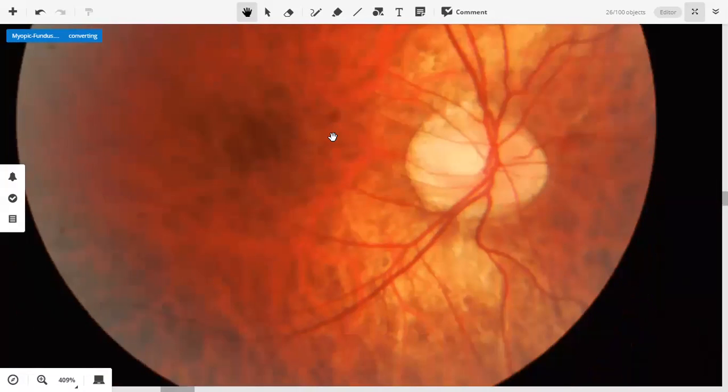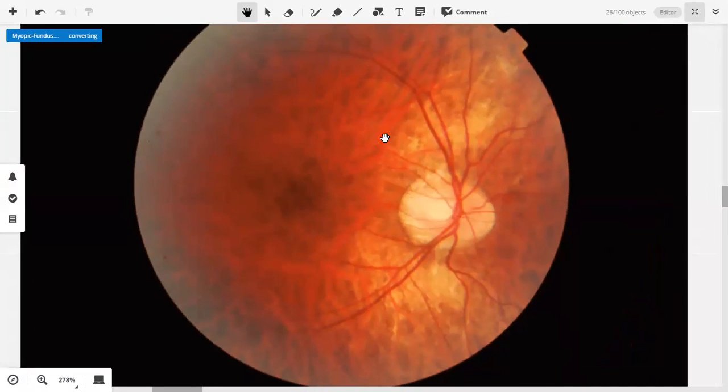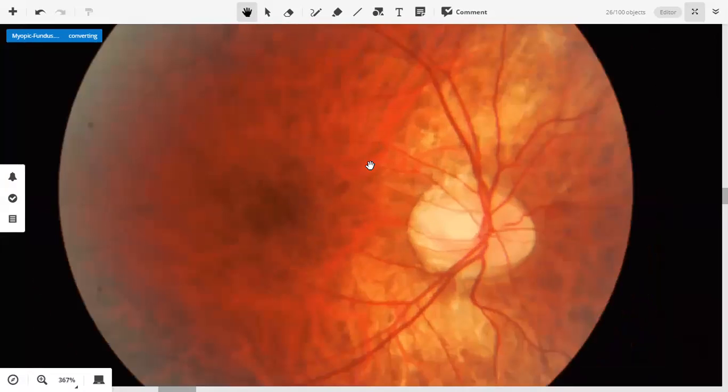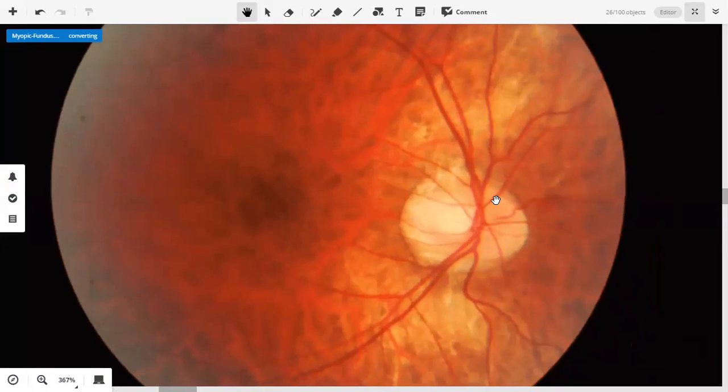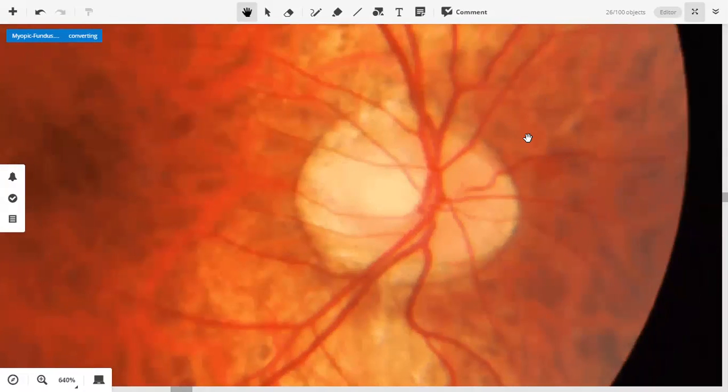So I'm seeing a few things. Now I'm going to tell you what is happening over here. In this image, when we take a closer look at it, we can see that the optic disc is oval, it's horizontally oval. Now, this is the normal retina, this is the retina in this case, मतलब normal तो नहीं है, जो भी है, this is the retina. This is the margin of the retina. Immediately against the margin, we have the disc.